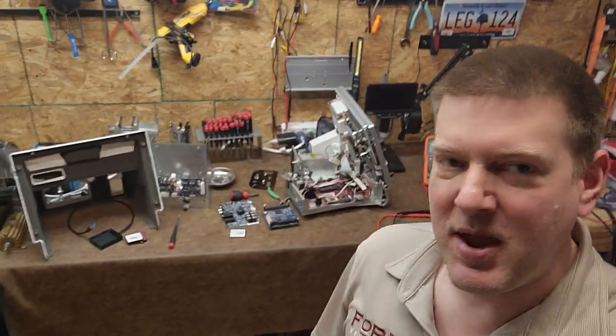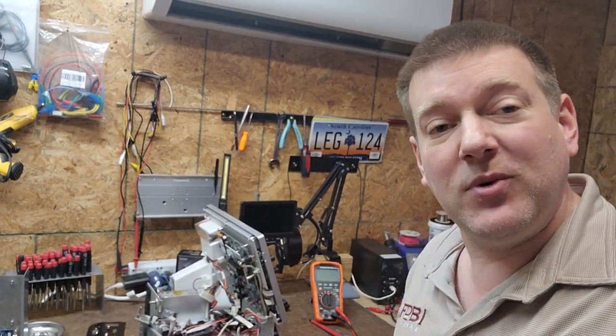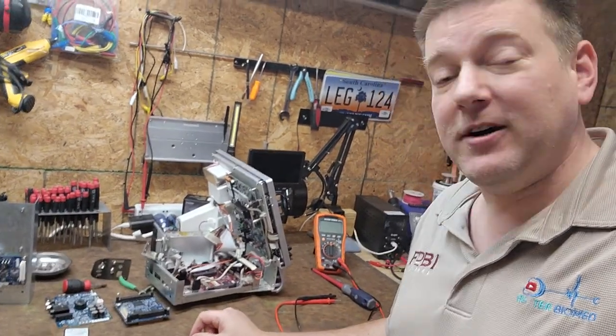Hey everyone, welcome back to Better Biomed. Today I have something on the bench here that's very expensive and it needs a lot of love. This would be the Medtronic NIM 3 Neuromonitor.